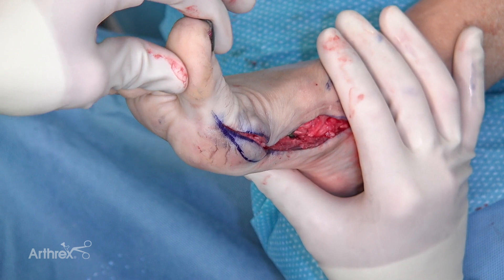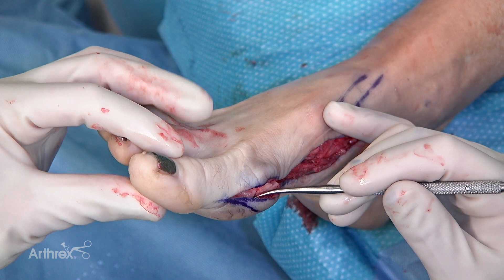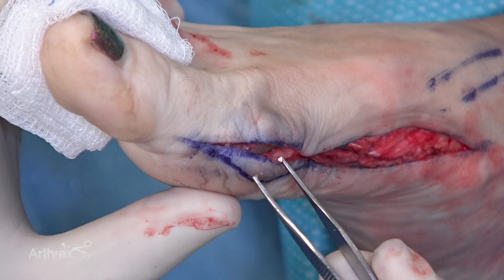When I hold her in the corrected position, I do see she has a little bit of redundancy of the medial soft tissue. So we'll go ahead and do a little capsulorrhaphy here to tighten this up and balance the first metatarsophalangeal joint. You can just close this, but they often fill in with scar tissue and still seem to have a bump. So I'll often do a little skinplasty and remove a segment of this as well, just being careful with that plantar medial nerve along this particular area.